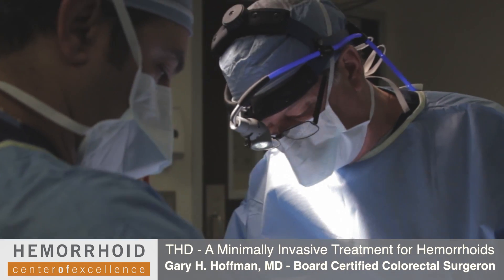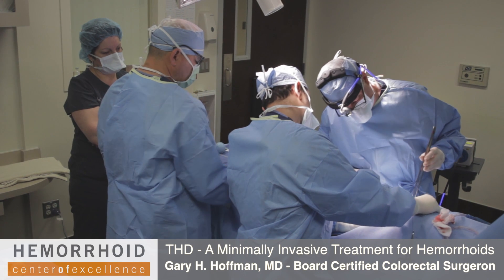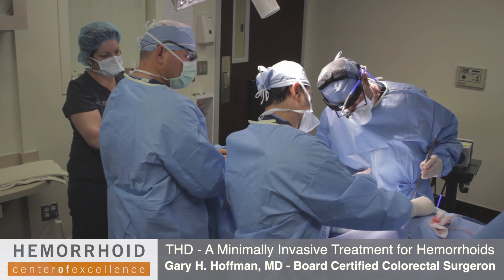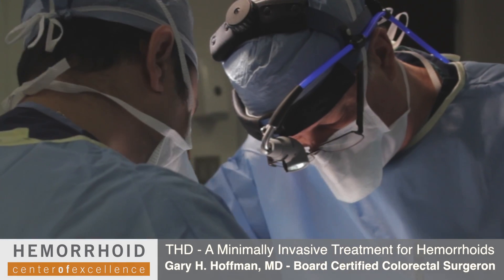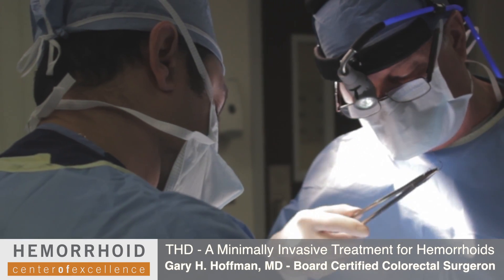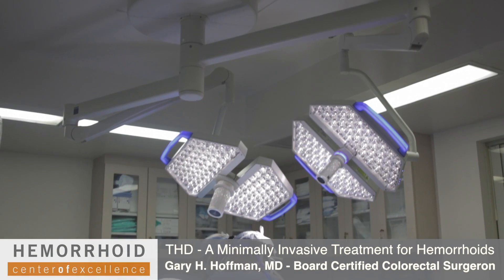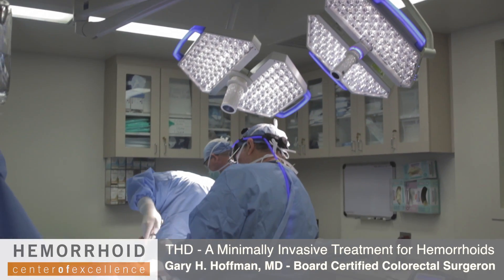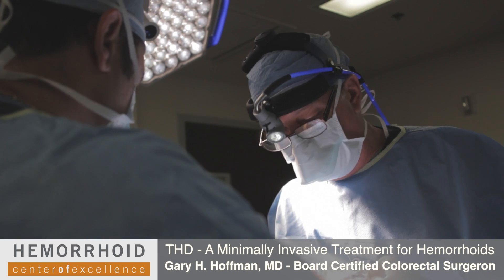Now I can directly see the hemorrhoid, and I'm going to sew it back into its position where it began. This requires approximately four to six stitches, and at the conclusion of placing the stitches, I'll be able to tie the stitches and effectively pull the tissue back inside. That completes the first one. We simply put the instrumentation back together and go on to the next hemorrhoidal group.